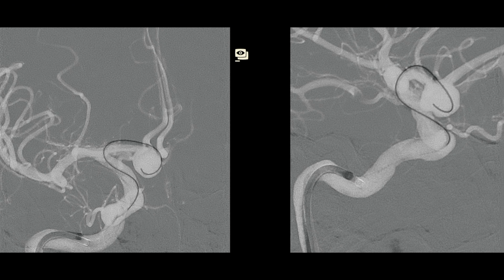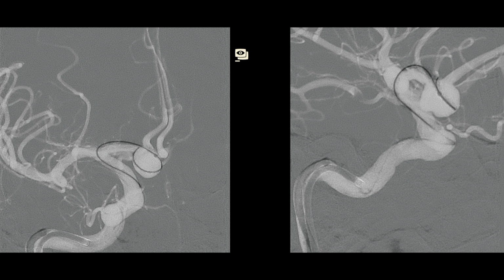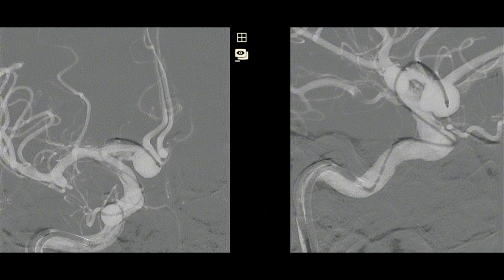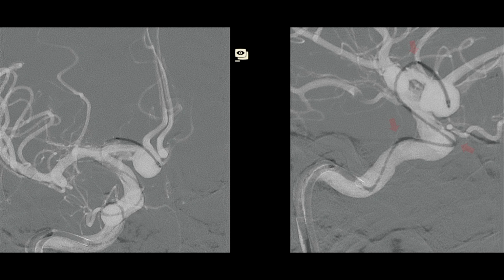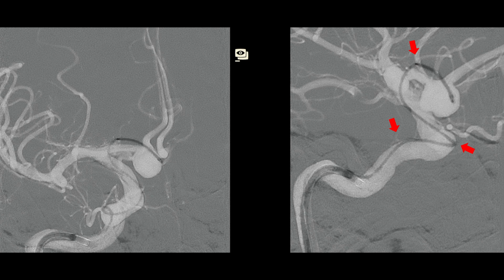For this ACOM aneurysm, an 8x5mm web device was delivered through a VIA-27 microcatheter. You can see significant tension on the catheter system here. Notice how the microcatheter is pressed tightly against the vessel wall. Given this strain, attempting direct device deployment would be unsafe at this stage.